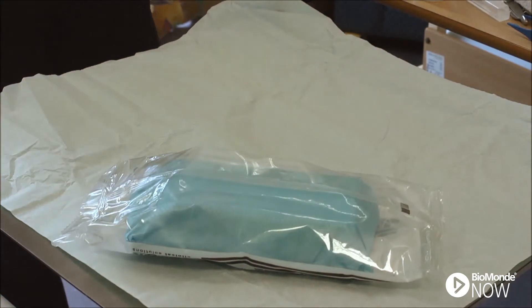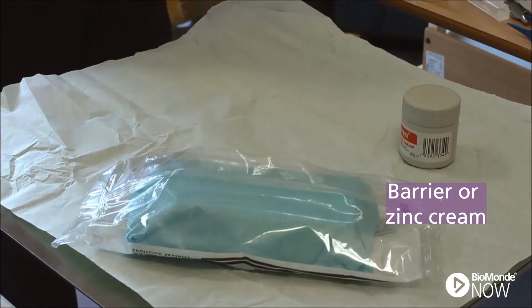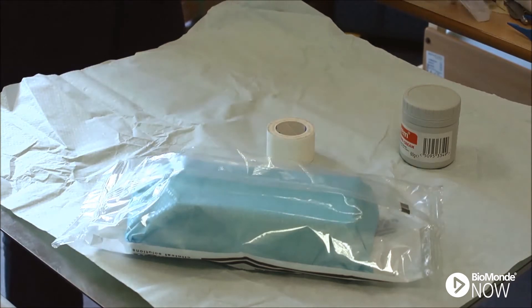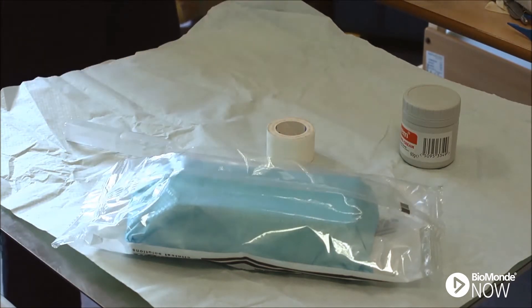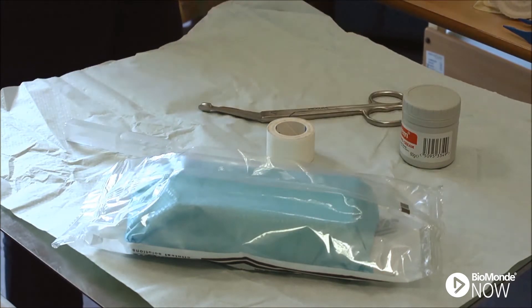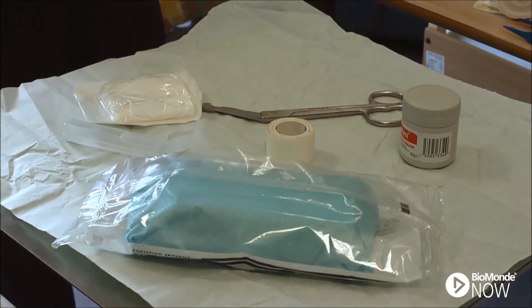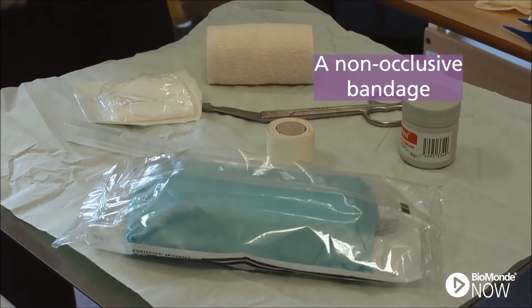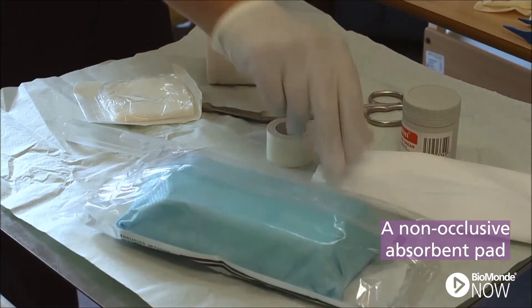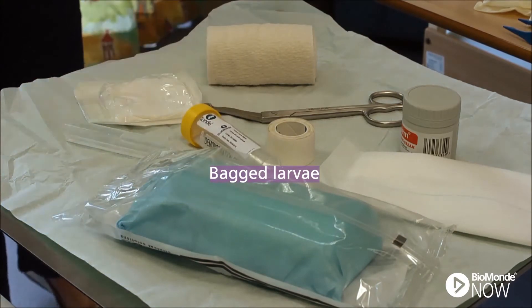To apply bagged larvae you will need a wound dressing pack, barrier or zinc cream, surgical tape, saline solution, scissors, a gauze swab, a non-occlusive bandage, a non-occlusive absorbent pad, and bagged larvae.